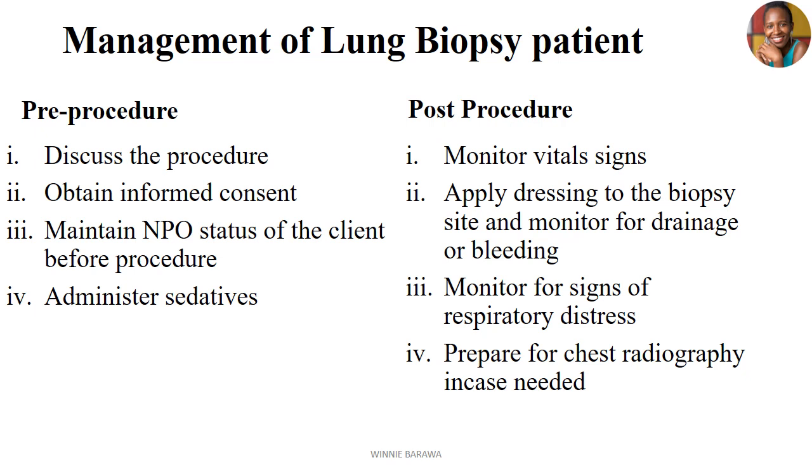Prepare for chest radiography in case you need it, that is, you want to see the progress and the status of the respiratory system after the procedure. Remember, you've gone in, you've gotten samples or tissues, and you may want to know how the patient is recovering from this. So that's why the chest radiography is important.